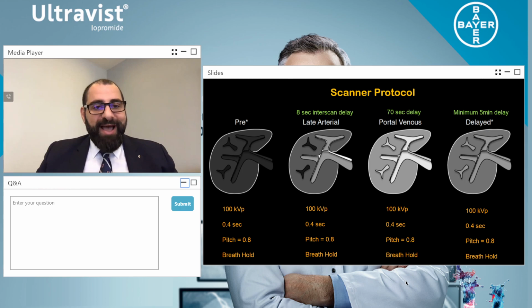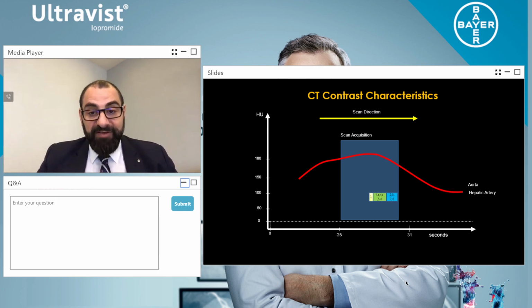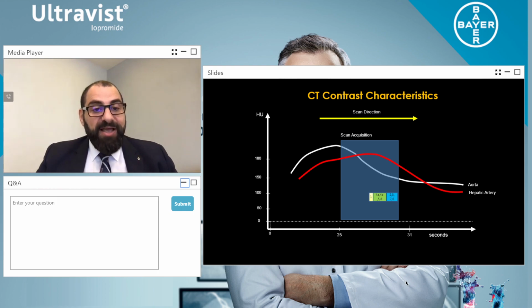So now let's have a look at the issues of contrast media delivery and the different lobes of the liver, how they're enhancing at different times. Did you know that between the first lobe of the liver versus lobe 2, 3, 7, and 6, there's about a 2-second interval or difference in enhancement? This is because of the direct blood supply coming from both the hepatic artery and the vein, as you can see in this graph. So that's why when we come to look at enhancement, we'd always want to do a late arterial phase, because every one of those 8 segments of the liver, we want them to be equally enhanced.